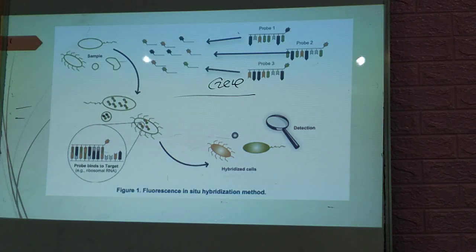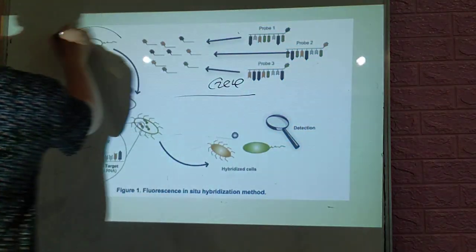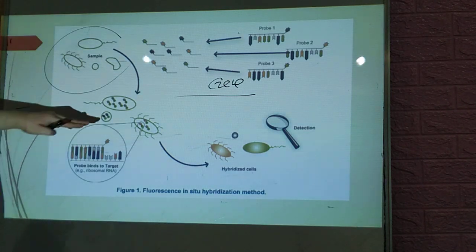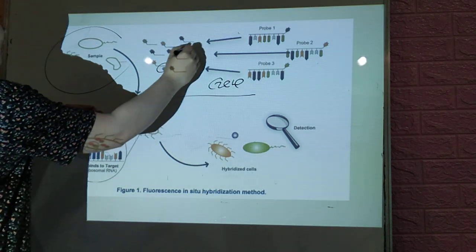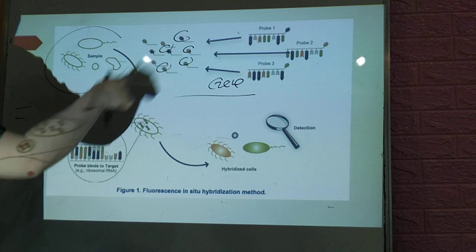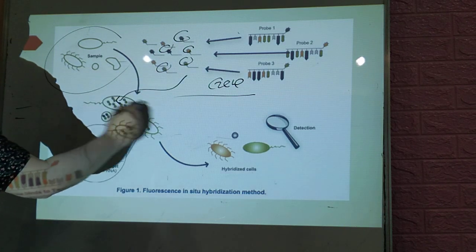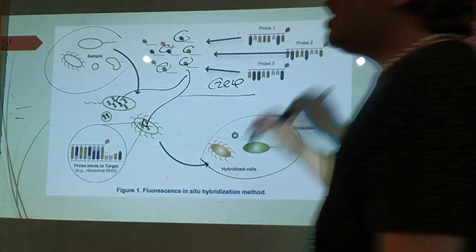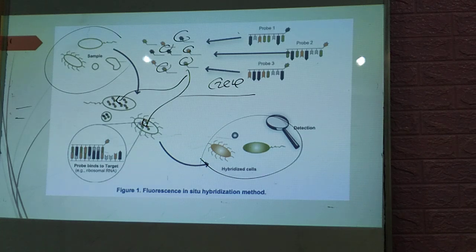Okay, so guys, as you can see in this picture, we have here our samples. From our samples, the probe will bind with any gene of interest that is present here. The probes are usually labeled with fluorescence. So what will happen here? In the presence of the gene of interest, it will bind with the gene of interest, which will be determined by an emission of fluor or the microscopic presence of fluor, using either, please take note, flow cytometry or microscopy respectively.